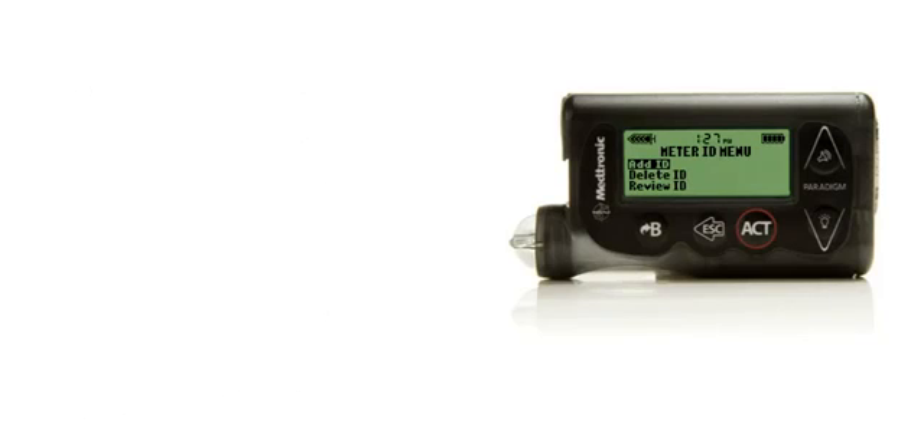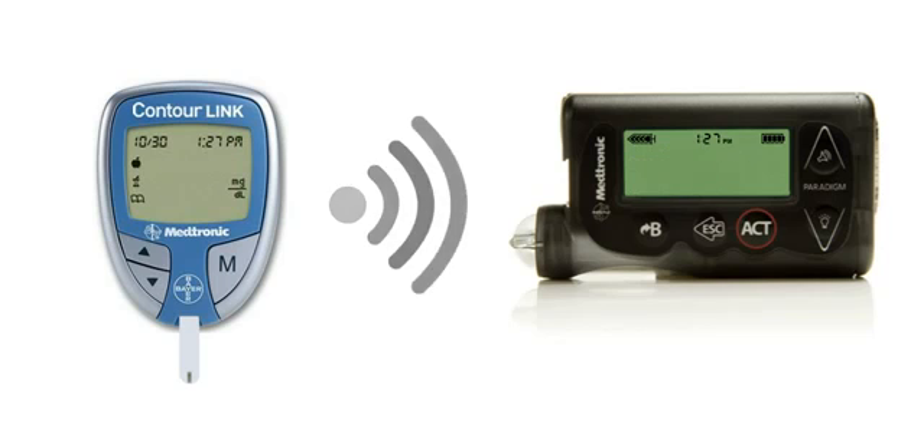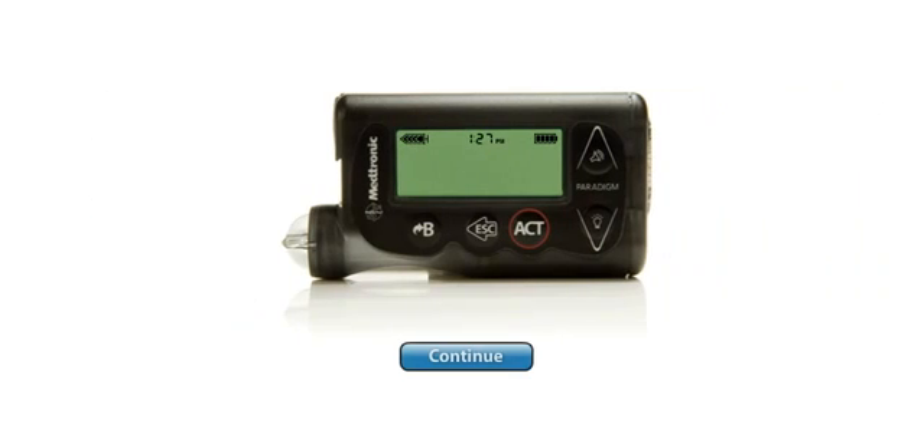Once you have finished entering in the Meter ID, test your BG to make sure your pump and meter are linked. If your meter is communicating with your pump, the meter reading should transmit automatically to your pump and show on your pump screen. Meter BGs that are transmitted to the pump are stored automatically in the pump's memory.